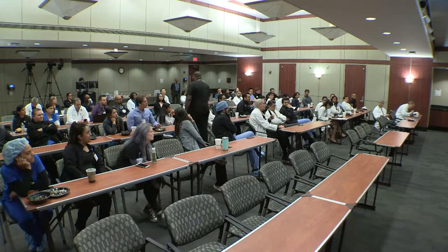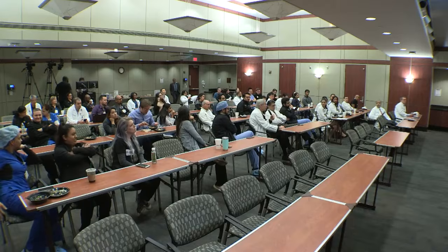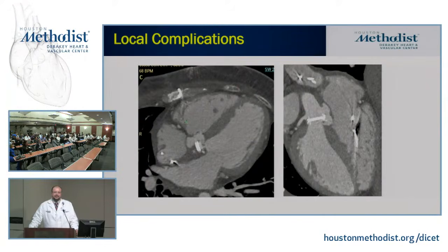And that's very true, but actually he's going to show a case right now, and I have the slides on this case too. We actually can see communications fairly well. We don't see flow, but we can see dehiscence and we can see leaks. Although CT has the highest spatial resolution, when the communication is so small, you're not going to be able to see it. If it's extremely small, exactly, you're not going to be able to see it.